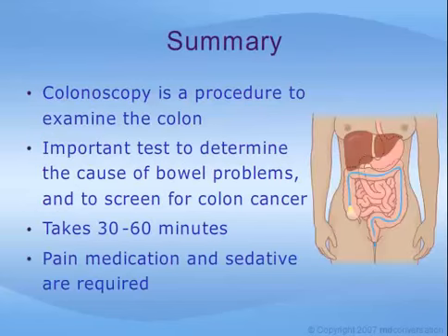A colonoscopy is a test that allows your gastroenterologist to look at the interior lining of your large intestine, also known as the rectum and colon, using a thin, flexible viewing instrument called a colonoscope. It enables the physician to see things such as inflamed tissue, abnormal growths, and ulcers. Prior to your colonoscopy procedure, you will receive instructions from your doctor. It is important to follow these instructions carefully, as a good preparation of the bowel makes for a better evaluation.